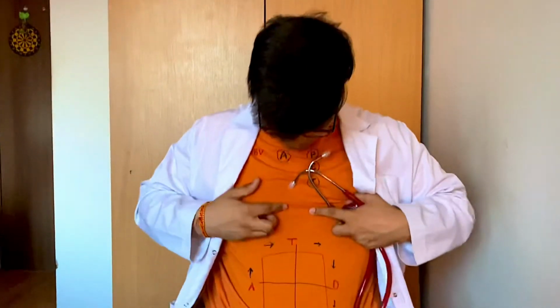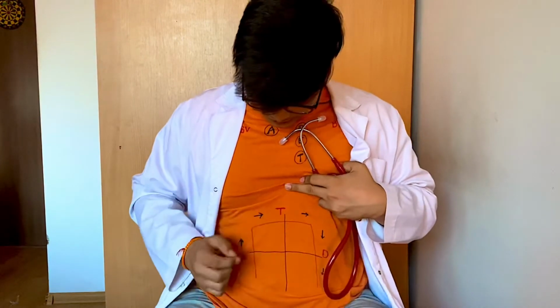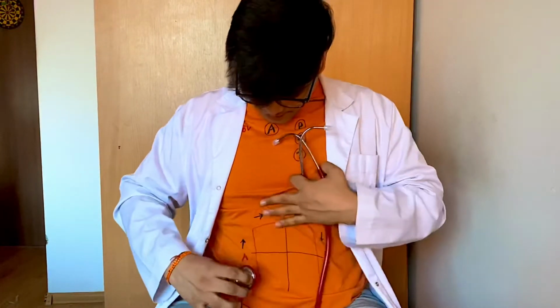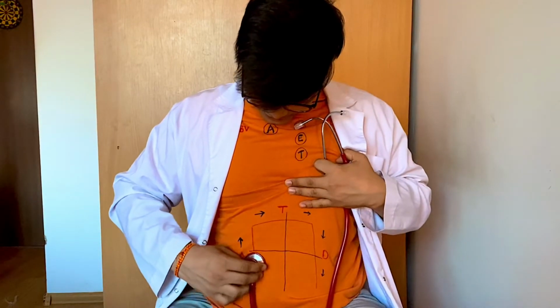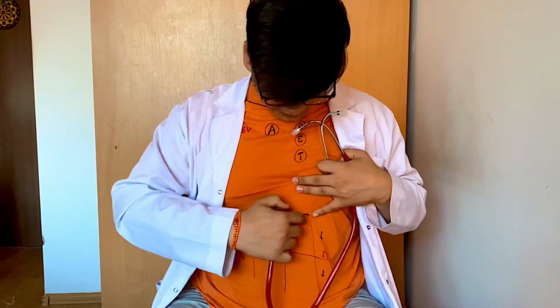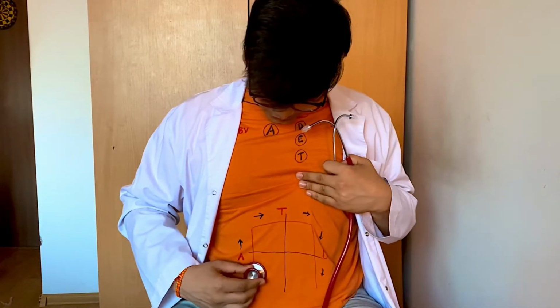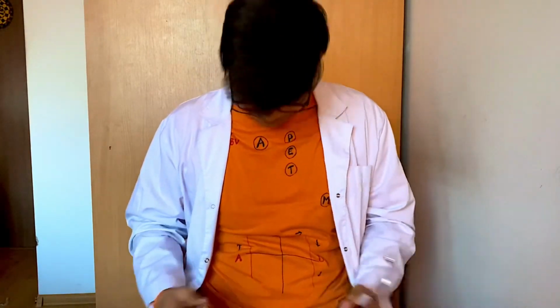And for the abdominal, you have to divide the abdomen into 4 quadrants, just like this. I have divided the abdomen into 4 quadrants, that is A, B, C and D. So you have to check the sounds sliding it clockwise. This is the ascending colon, this is the transverse colon and this is the descending colon. At each quadrant you have to hear for almost 3 to 2 minutes, which is advised in the textbooks, but you can hear it from 1 to 2 minutes as well.